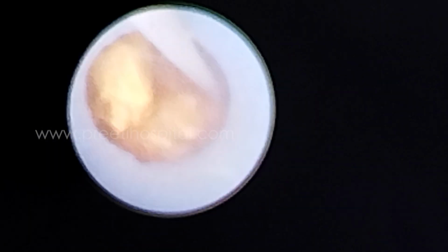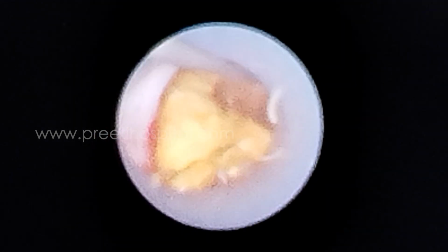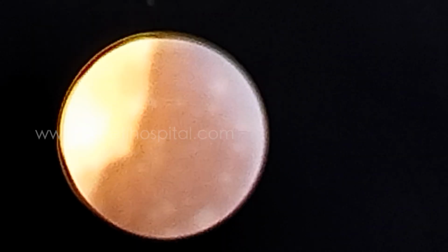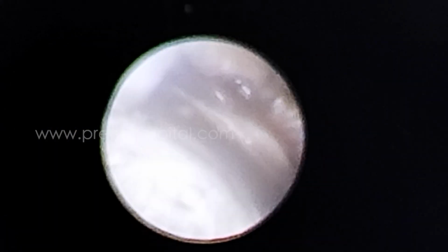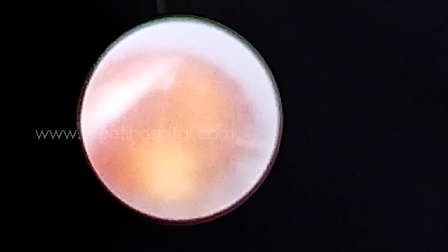Now, if you feel that you have made adequate pieces, rotate and take the grasper and take out. See, the stones are coming into the dependent part. Flush. If you take out the guide wire, they will come better. You can take out the guide wire. In supine PCNL, this is a disadvantage and an advantage.